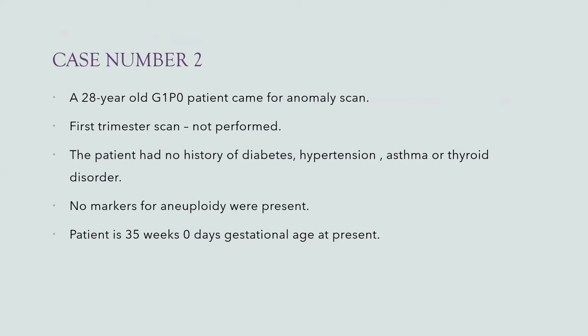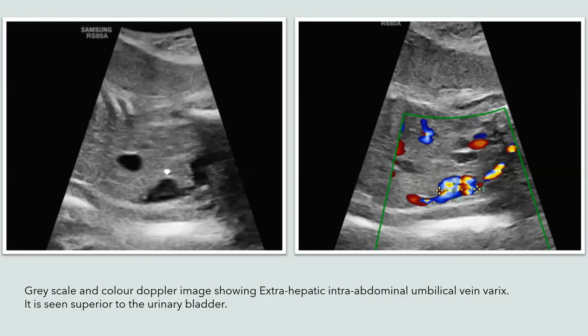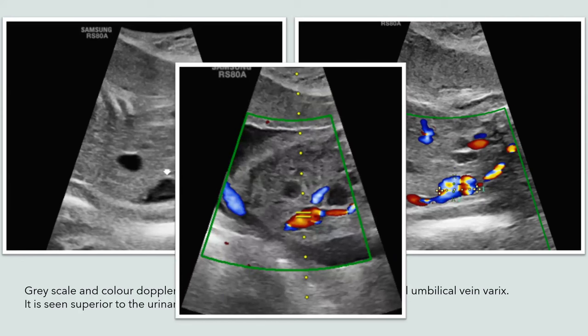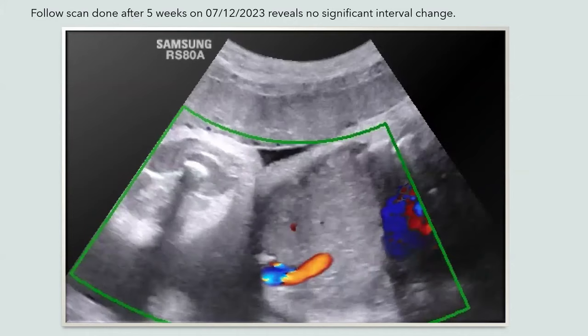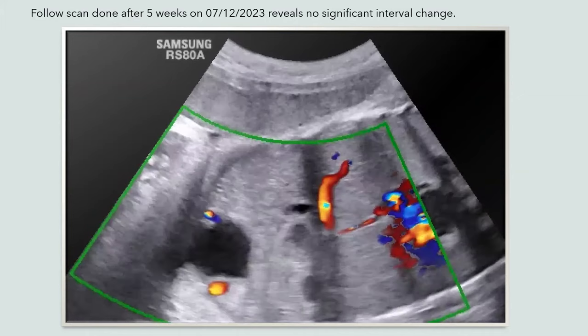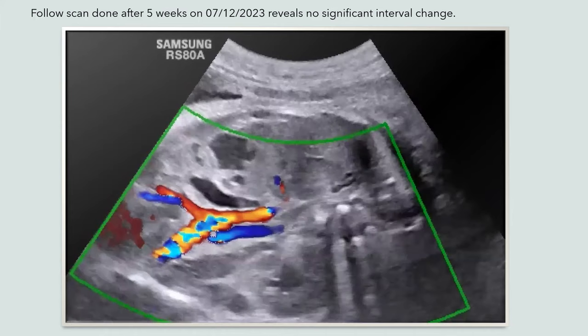Case number 2: a 28-year-old G1P0 patient came for an anomaly scan. The first trimester scan was not performed. The patient had no history of diabetes, hypertension, asthma, or thyroid disorder. No markers for aneuploidy were present. Patient is at 35 weeks 0 days gestational age. Grayscale and color Doppler image showed extra-hepatic intra-abdominal umbilical vein varix, seen just superior to the urinary bladder. Follow-up scan done after 5 weeks revealed no significant interval change, no obvious thrombosis was seen, and the ductus venosus showed normal color flow.